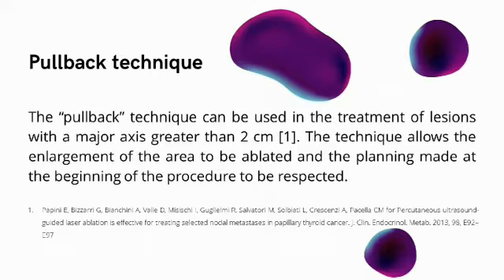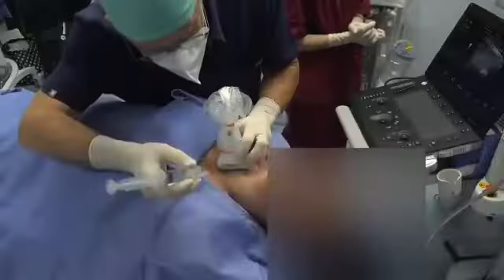One or two pullbacks can be performed during the procedure. The pullback must be programmed during the planning phase in order to respect the blue area, which is the safe area where necrosis is carried out.